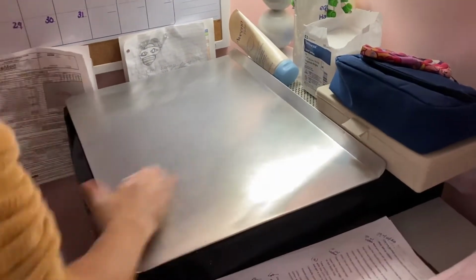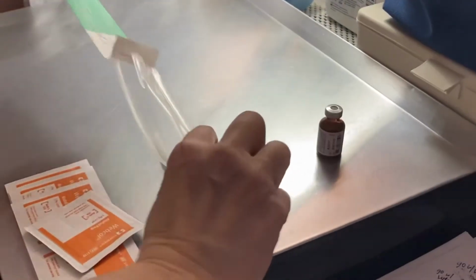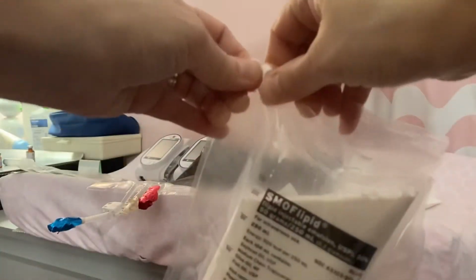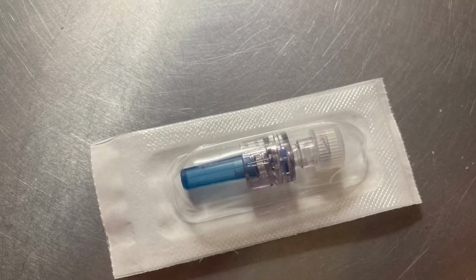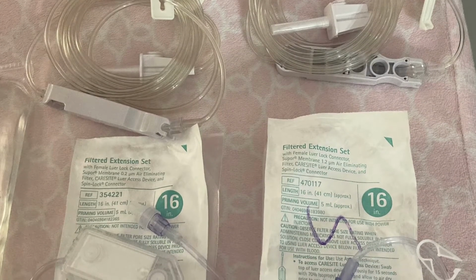Use 1 alcohol pad to wipe down the cookie sheet. I pop the lids off the vitamins. Put the syringes on the table in front of the appropriate vial, small with small and large with large. Open the lipids bag and place on the cookie sheet. Open the anti-siphon package and take out the 2 pumps. Open the filter and tubing bags.